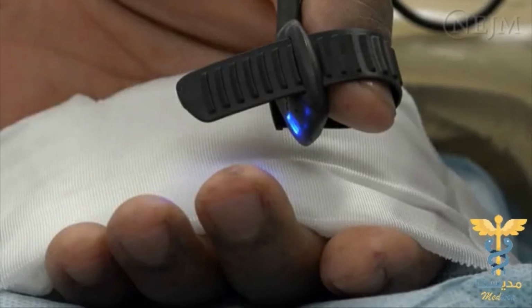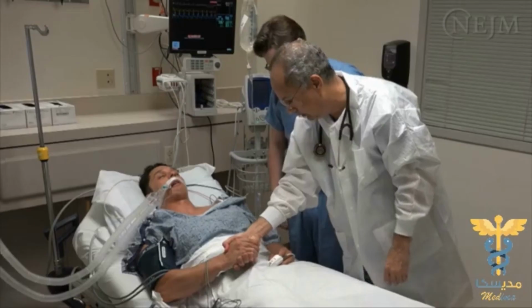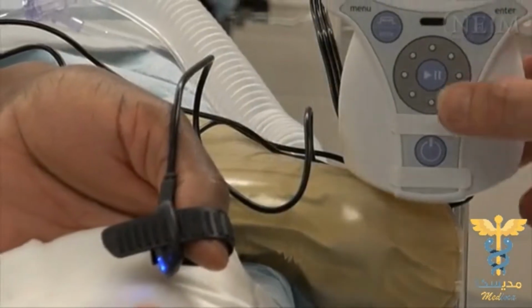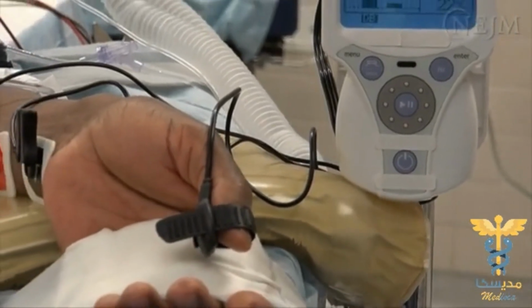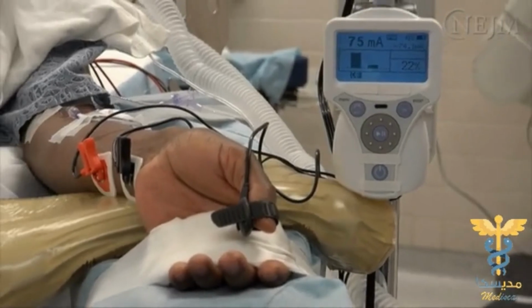Monitoring neuromuscular function is recommended whenever neuromuscular blocking agents are used. Clinical or subjective assessment is unreliable. Routine nerve monitoring performed with objective measurement techniques provides additional safety with minimal risk to patients and helps to avoid potentially life-threatening complications.